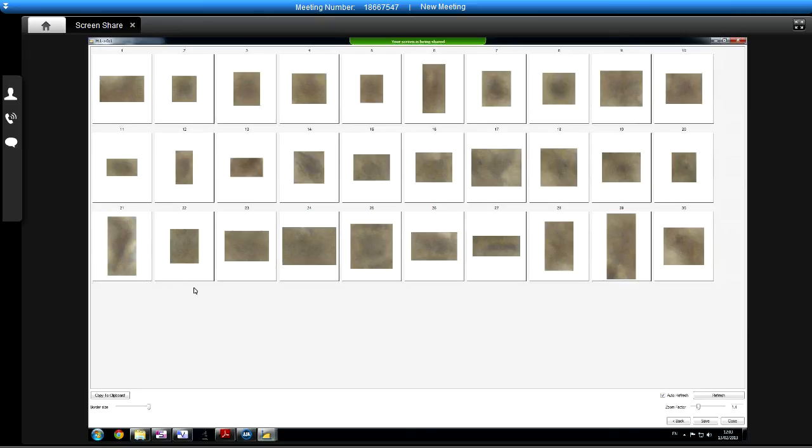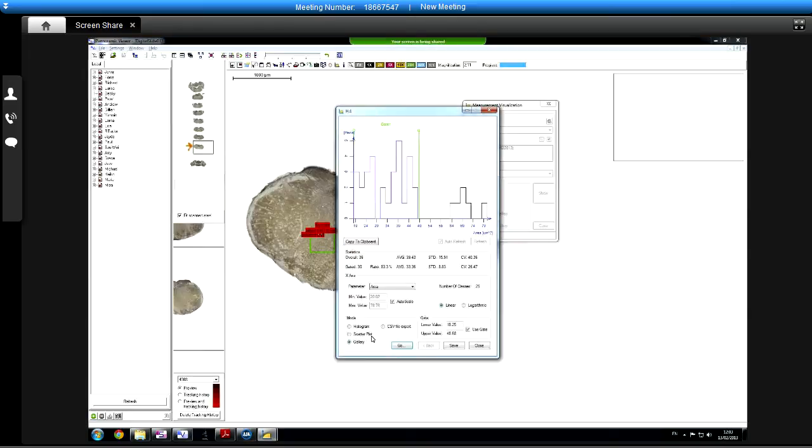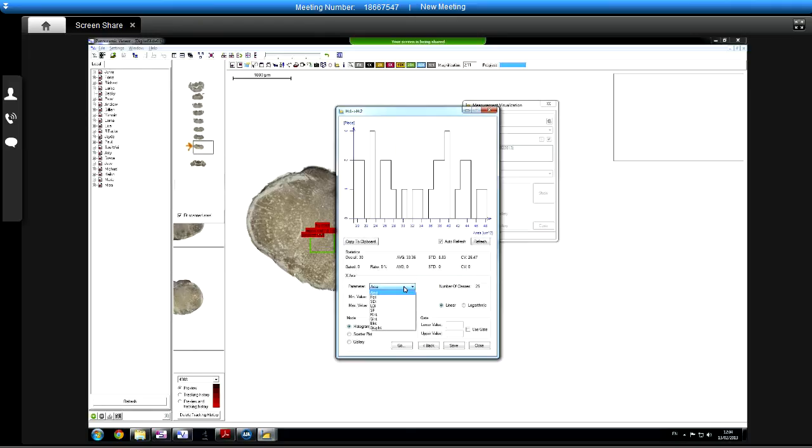But as I say, we can generate this, and we can go around this loop as many times as we like. So we can also click on histogram and say, now do a secondary gate, but this time I'm only interested in ones where the perimeter is in a certain range. And so we can hone down like that.